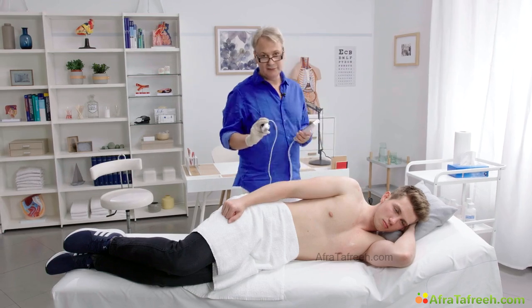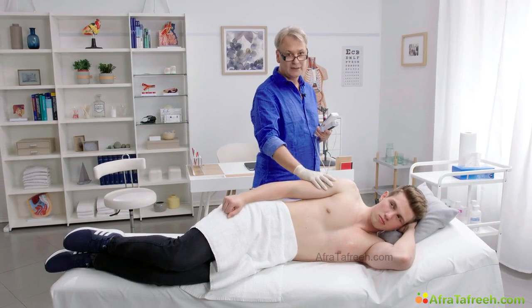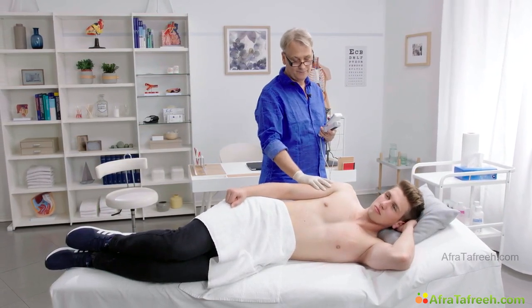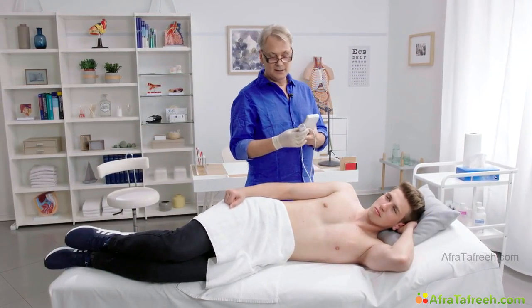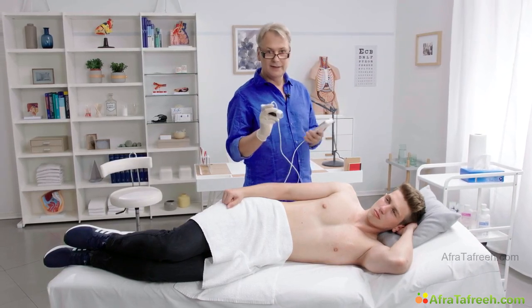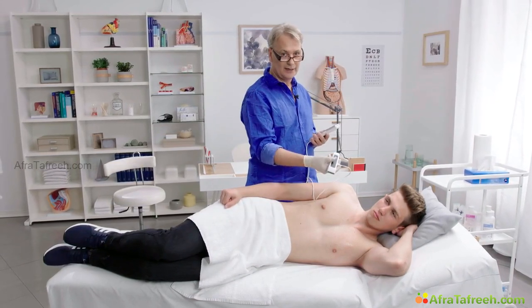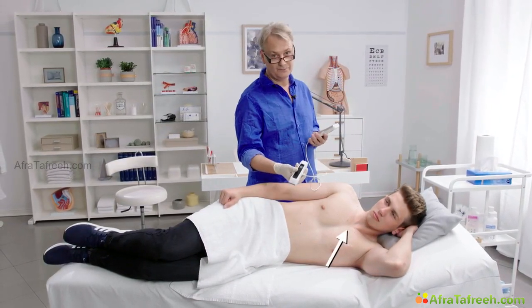Next, I will show you the apical four-chamber view. If you image from the apical four-chamber view, you'll position the patient also in the left lateral position, but a little bit more on his back. You'll be using, again, the index finger on the marker, but this time the marker will be pointing lateral and will be imaging upwards towards the head, almost to the right shoulder.